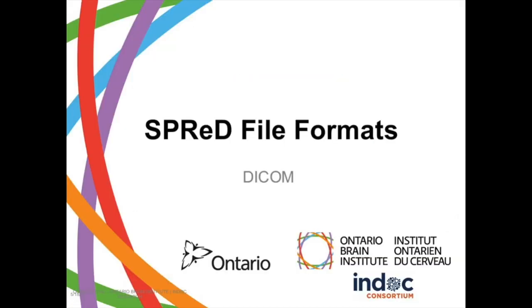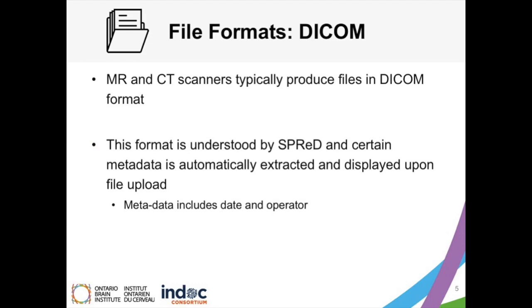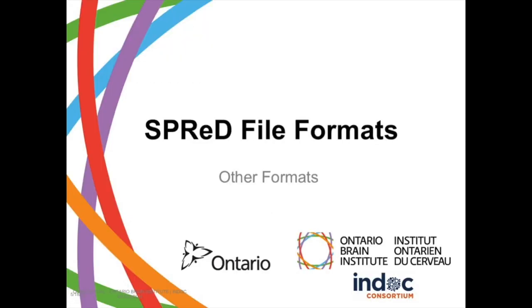SPReD file formats, DICOM. MR and CT scanners usually produce files in the format DICOM. This format is understood when uploaded to SPReD, and thus certain metadata is automatically extracted and displayed upon file upload. This metadata will commonly include date and operator.